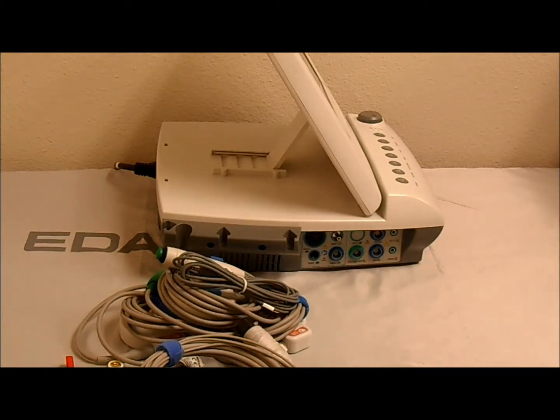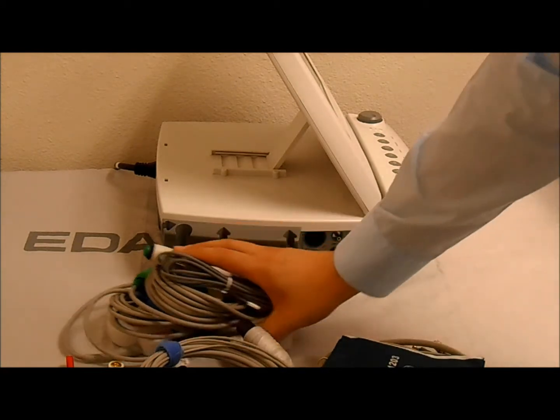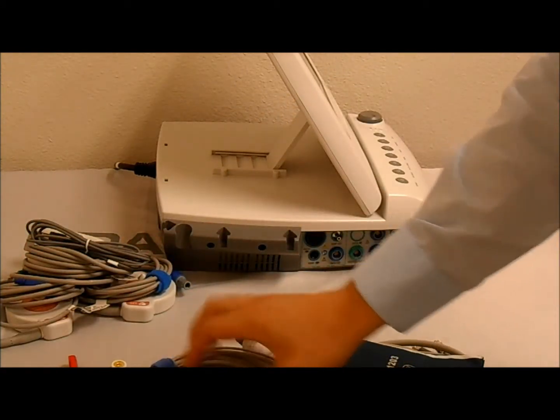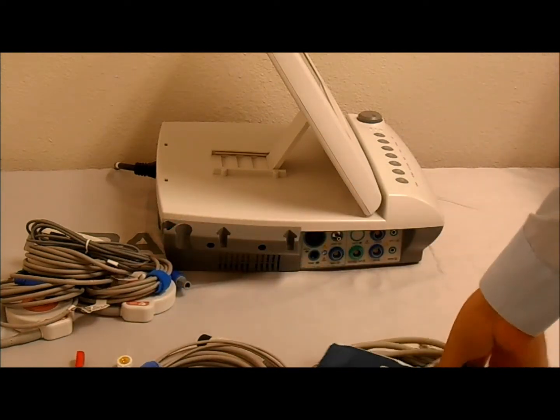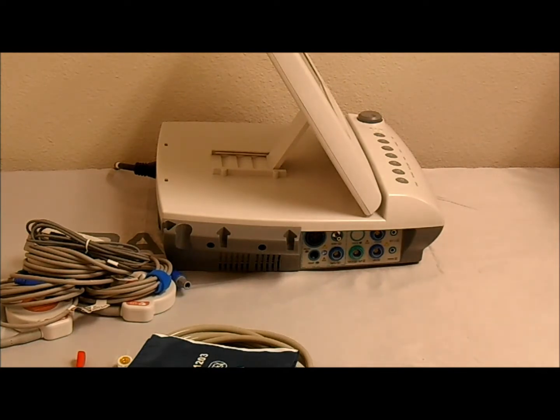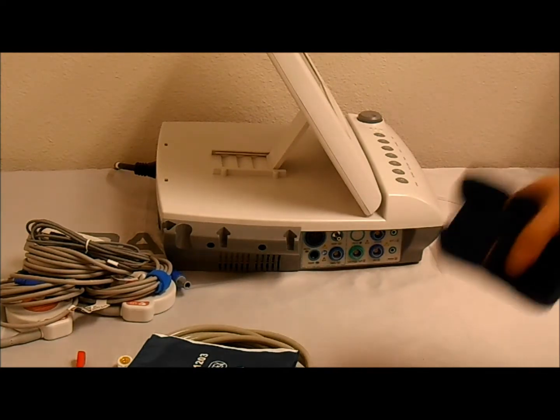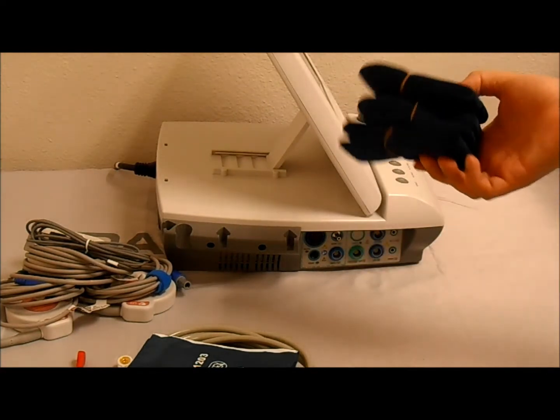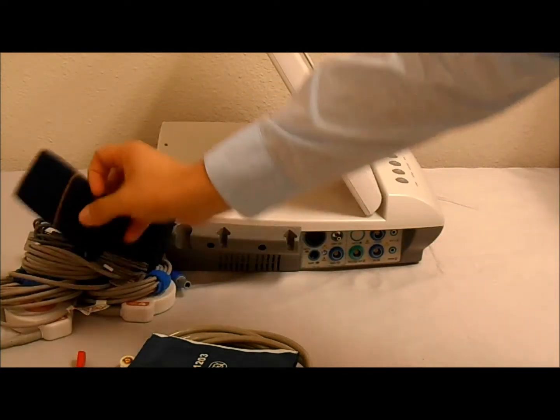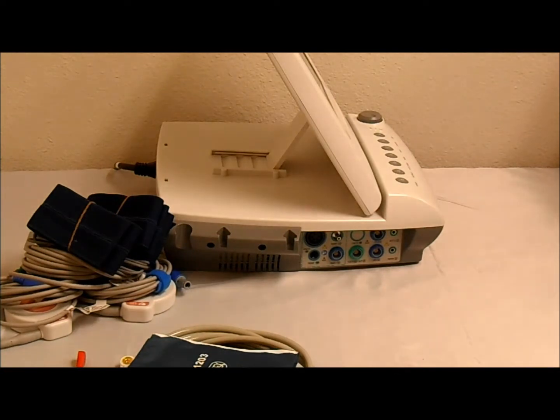Alright, so these are your core accessories. Again, the transducers are for getting your CTG waveform, and your EKG, SpO2, and NIBP are for taking readings on the mother. In addition to that, there are also 3 belts provided, which are intended to be used for the FHR transducers to keep them on the patient.